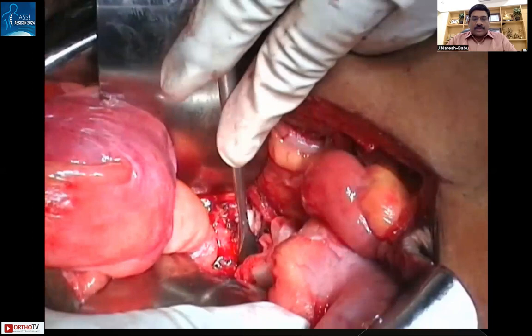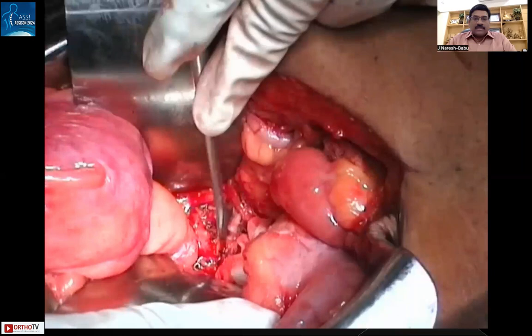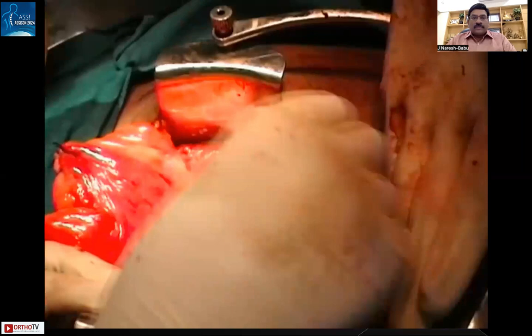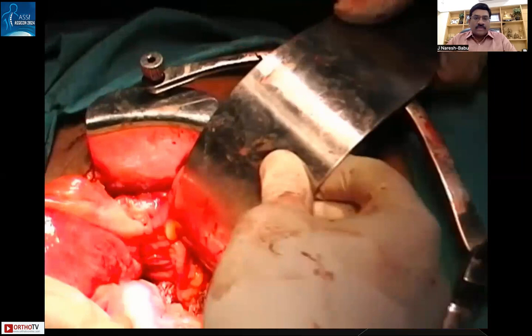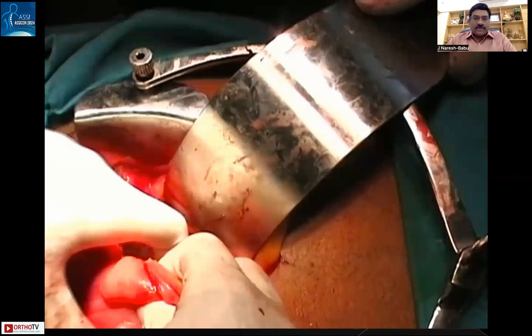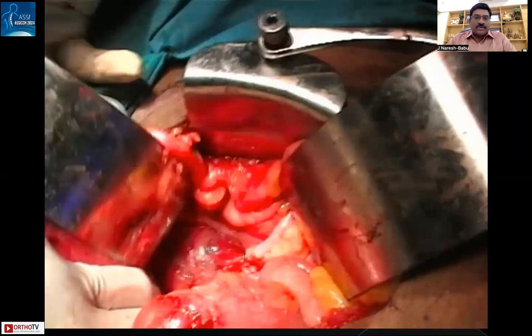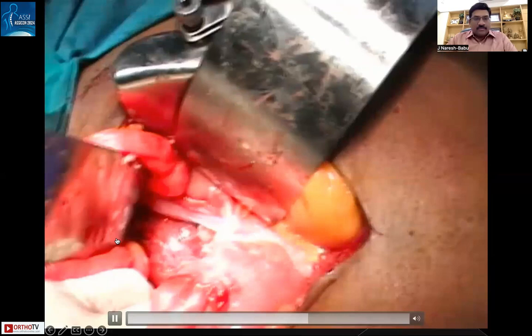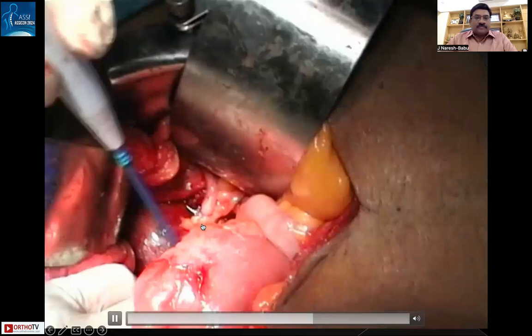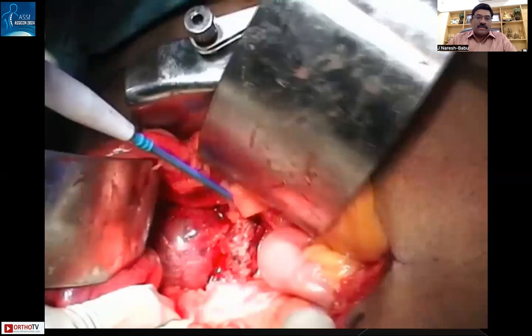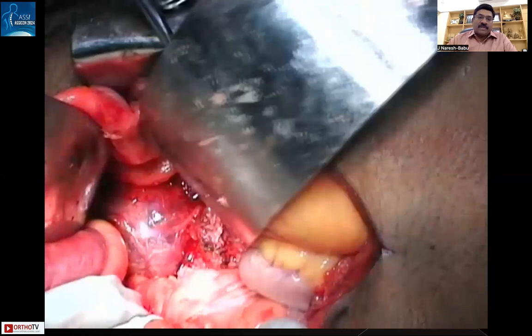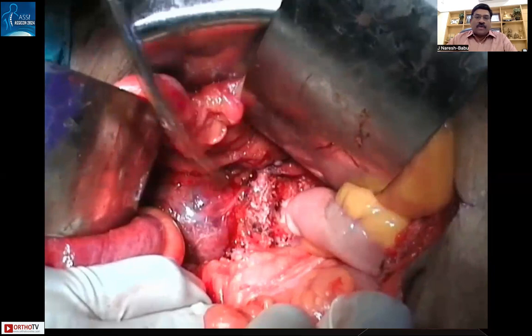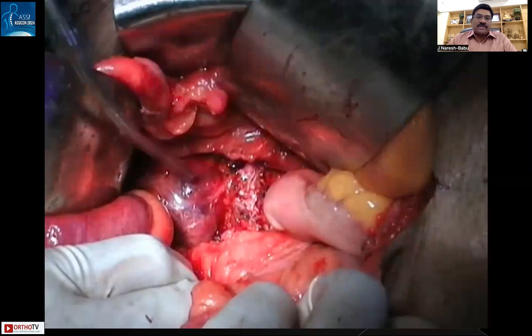The S1 superior endplate is separated and then the disc between the two endplates is completely removed. At the end of the anterior procedure — going layer by layer — after transperitoneal exposure, bowels and mesentery are separated, you reach directly the sacrum and can identify the extensive sacral tumor. The discectomy separates the sacrum so that posterior removal becomes easier, and the ligated blood vessels are visible on both sides with the tumor's intact capsule.